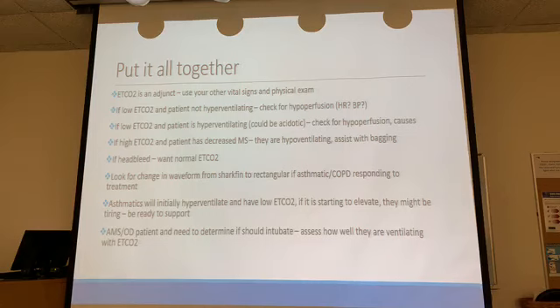So there's a couple examples here. If you have a low end-tidal CO2, right? It's really low, and your patient is not hyperventilating, what do you need to do? Check a blood pressure. Make sure the patient is perfusing. Make sure there's pulses there. Make sure their blood pressure isn't in the toilet or their heart rate's not 20. Because remember, ventilation and perfusion is required to have an end-tidal CO2, right?